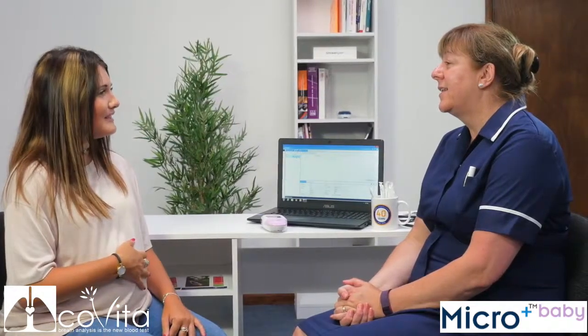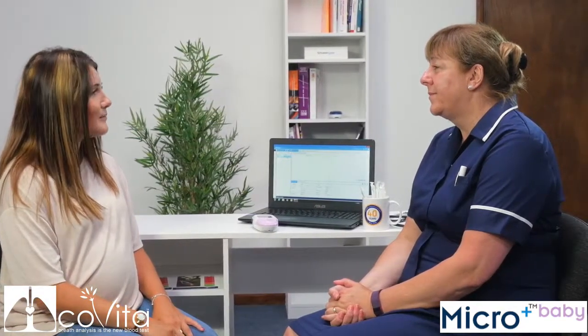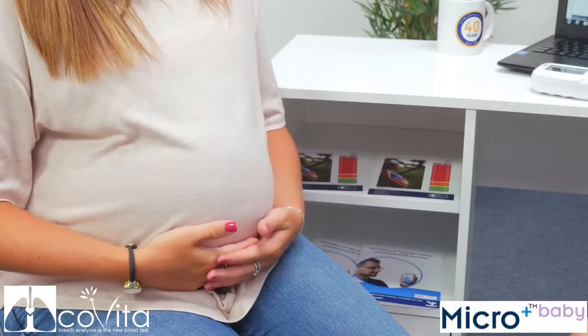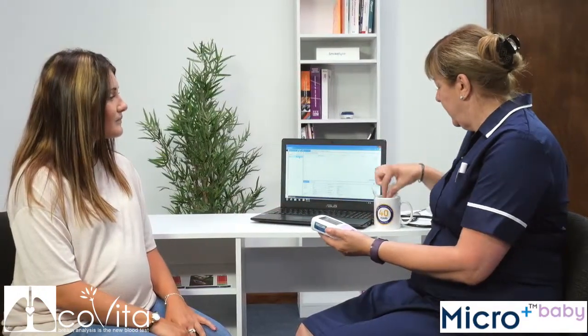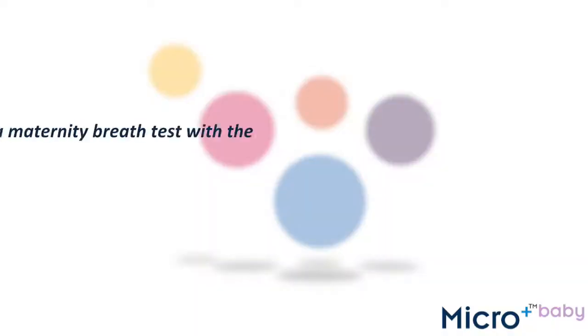The Micro Smokerlyzer has been specifically designed for midwives to help mums-to-be quit smoking. It works by non-invasively measuring carbon monoxide on a smoker's breath and also calculates the amount of CO that is affecting the unborn baby.